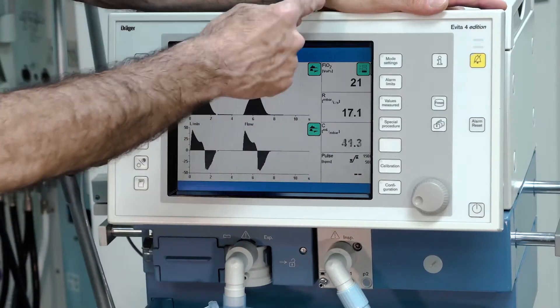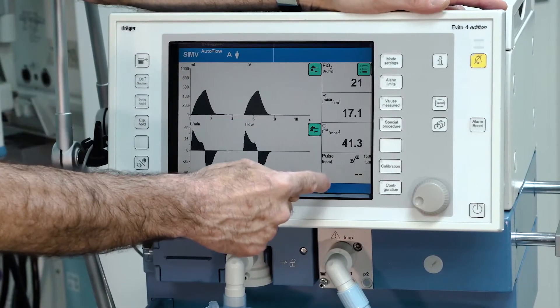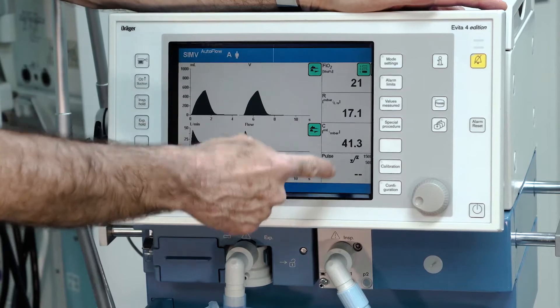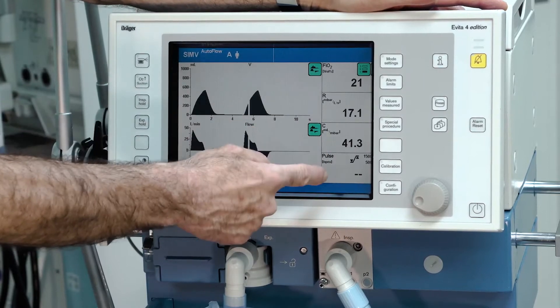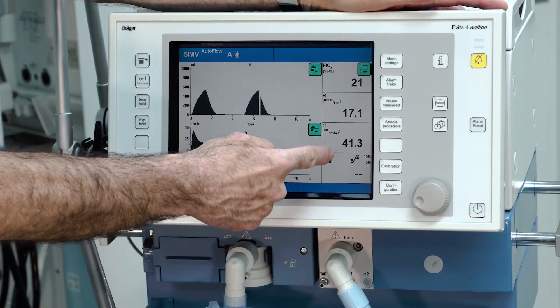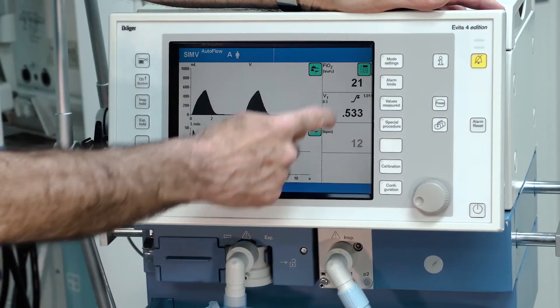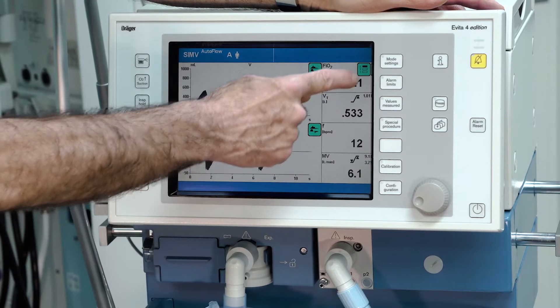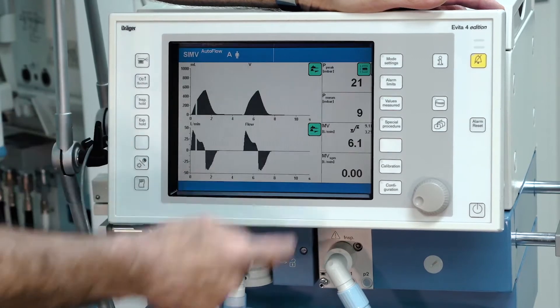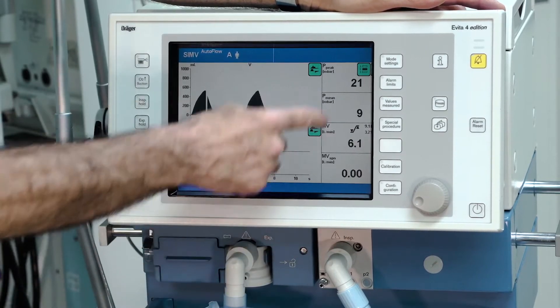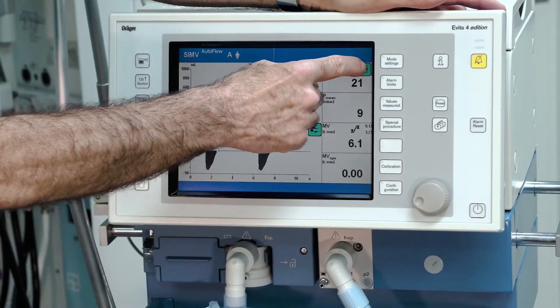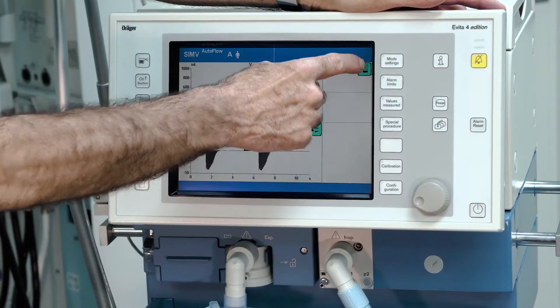You have three sets of pre-configured measured values on the right side. To toggle between these three sets, just push the button in the right upper corner.